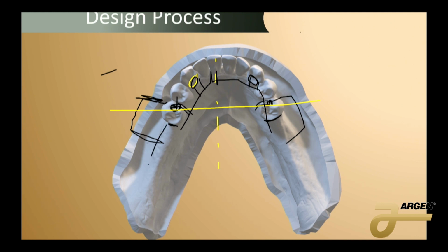And then lastly, we can decide where our mesh goes. This is exactly how I would do this. And then I would come into 3Shape, come into exocad, click all of the buttons, make a nice beautiful design, following some of those guides that we spoke to before of minimum thicknesses, minimum heights, following kind of all those guides. But deciding where these parts need to be is almost the more difficult part.